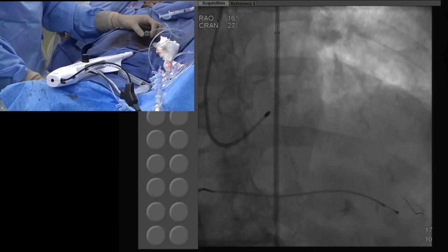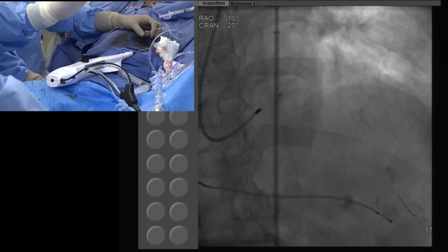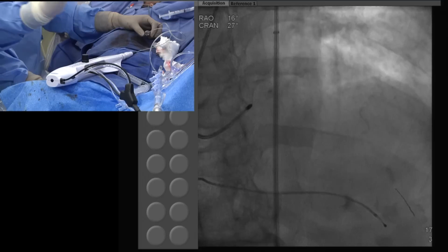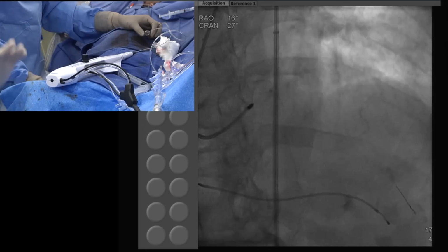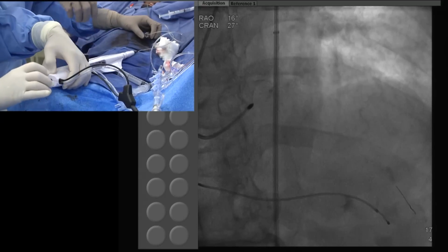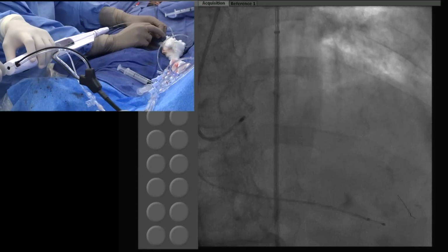I would say this is the kind of case you'll couple with, and that is where the whole question came down to: what's wrong with Impella. I would say this patient is a little younger, no issue about dual antiplatelet therapy, no issue of the NOAC. It's definitely appropriate to do the Impella. Now, Impella has advantages, but also a higher vascular complication rate, which we need to be worried about. That's the reason we did not use Impella in this particular case.